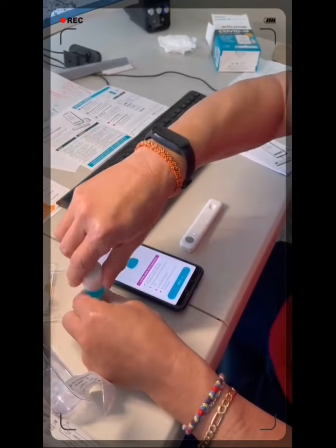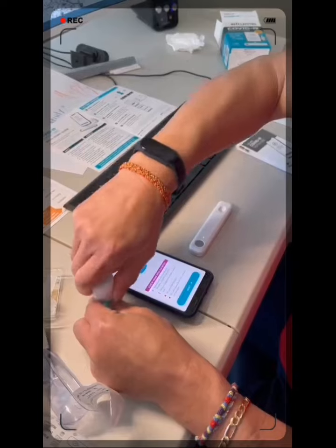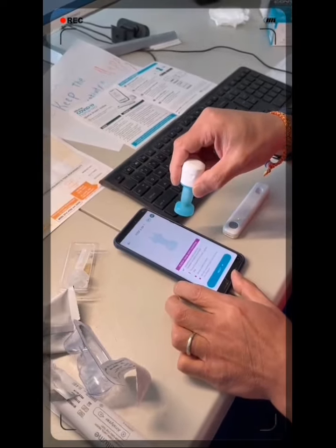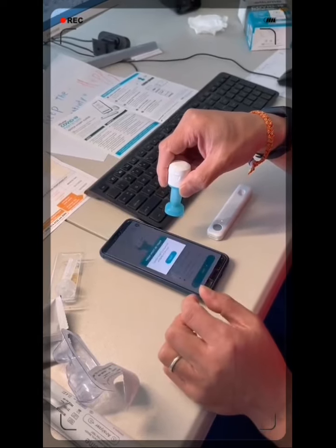Put this in. Tighten as much as possible — force if required to create a proper seal. Do not shake. Do not remove swab once screwed.